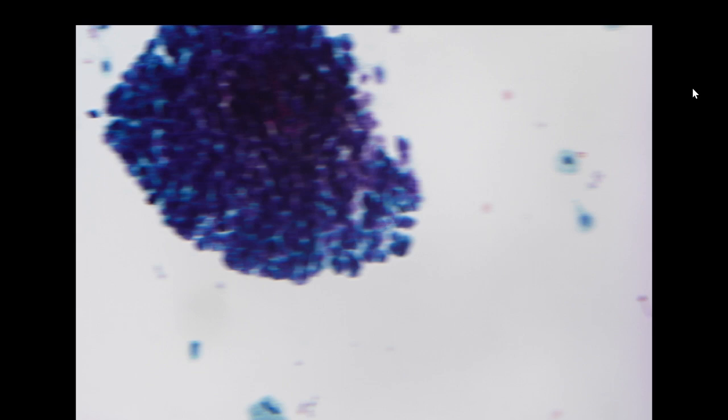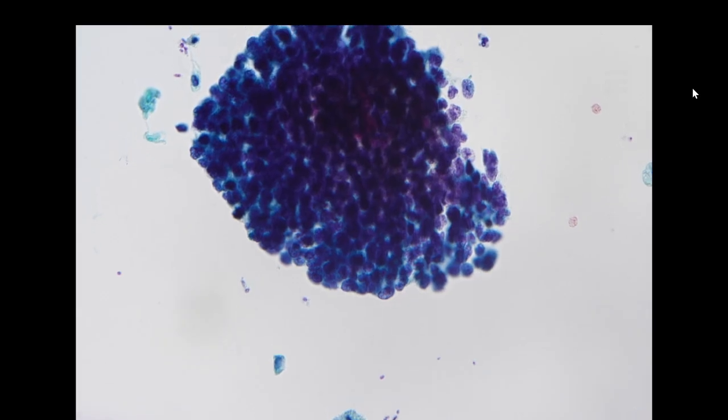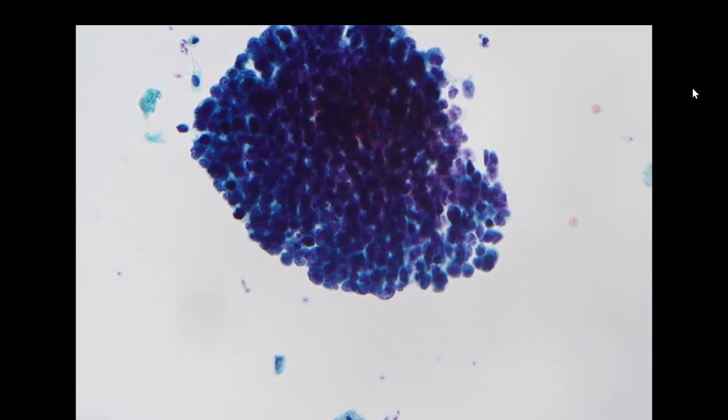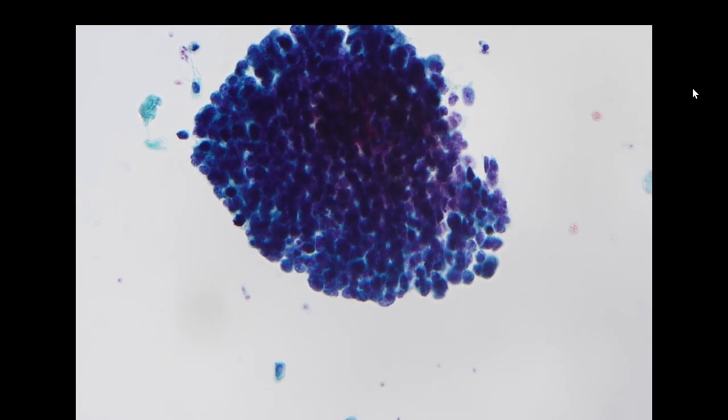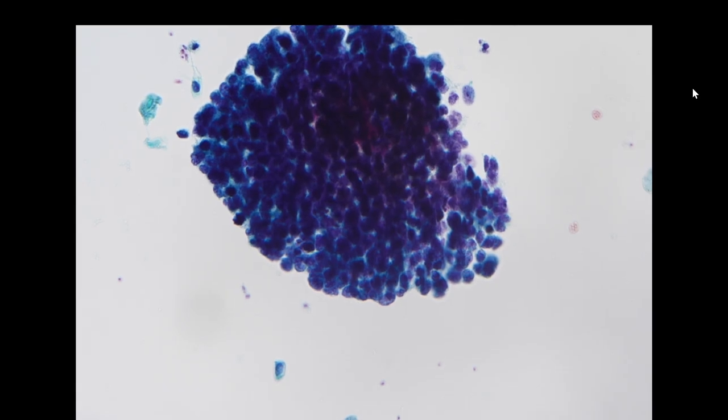And because the patient already has multiple disease sites with distant metastasis, it's a little bit uncertain if it is actually coming from the prostate, or it could be a lung primary small cell with multiple metastases, including the prostate. But because the patient already had a TRUS biopsy confirming that the prostate is positive for small cell carcinoma, and the prostate is connecting to the urethra, the tumor cells can shed into the urine.